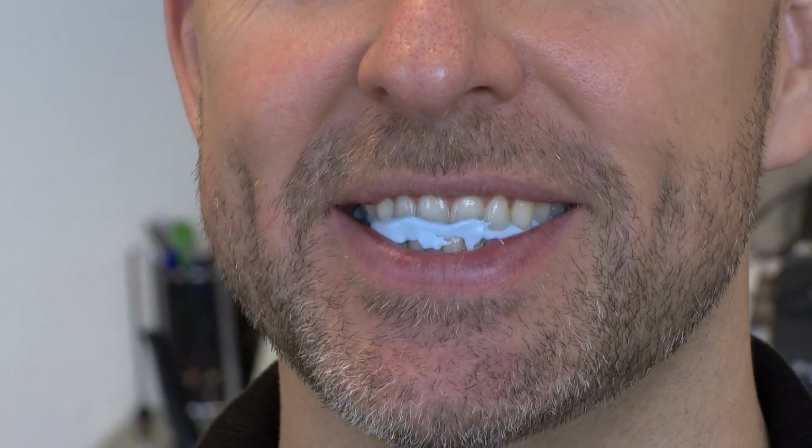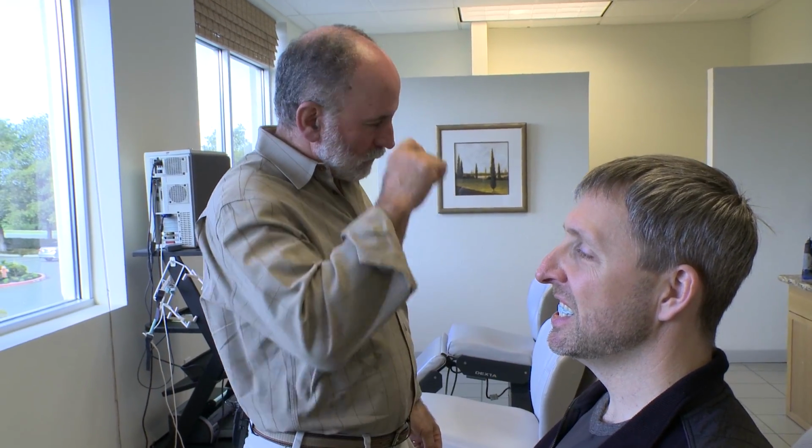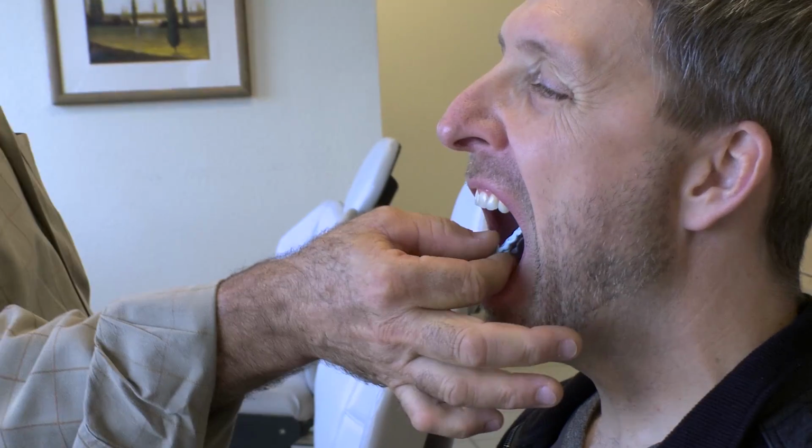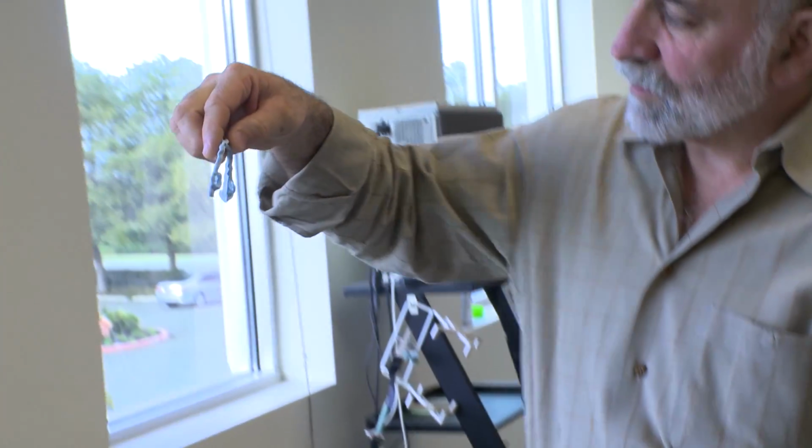Okay. And bite on your back teeth, stay closed. We see that nice end-on-end bite, very good. Open for me there. All right. Then we hold this up to the light, and it tells us how everything's touching.